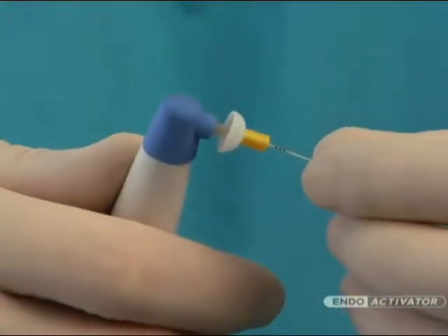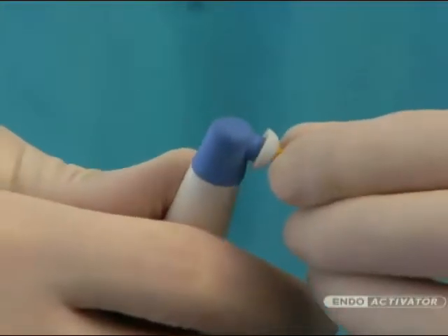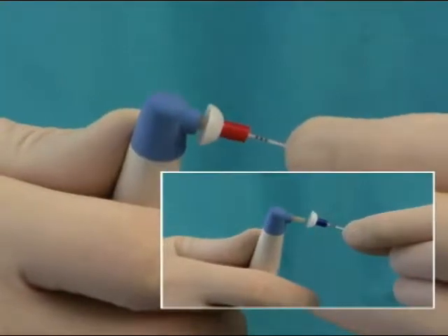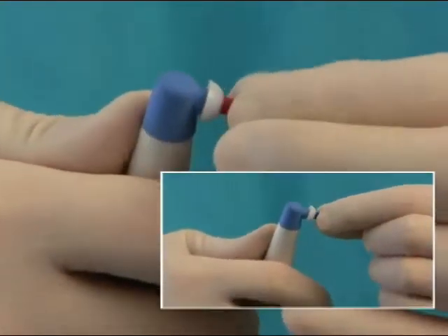The Indo-Activator tips have an easy snap-on, snap-off design and are color-coded yellow, red, and blue corresponding to small, medium, and large sizes respectively.